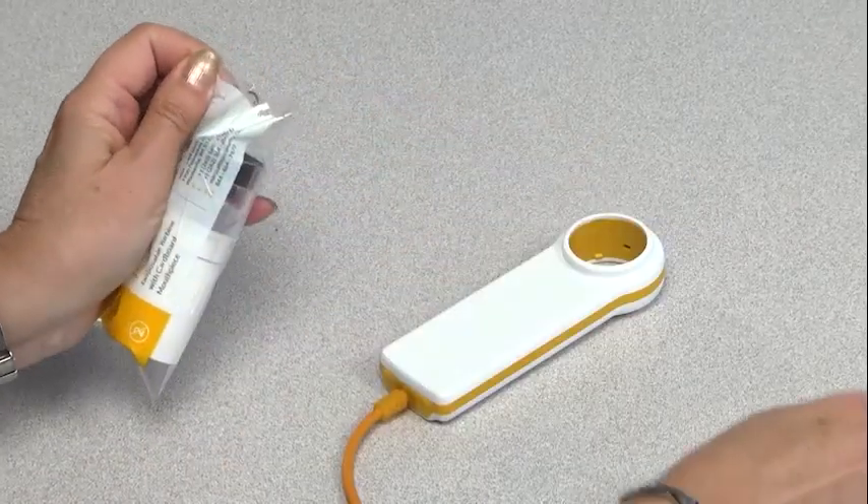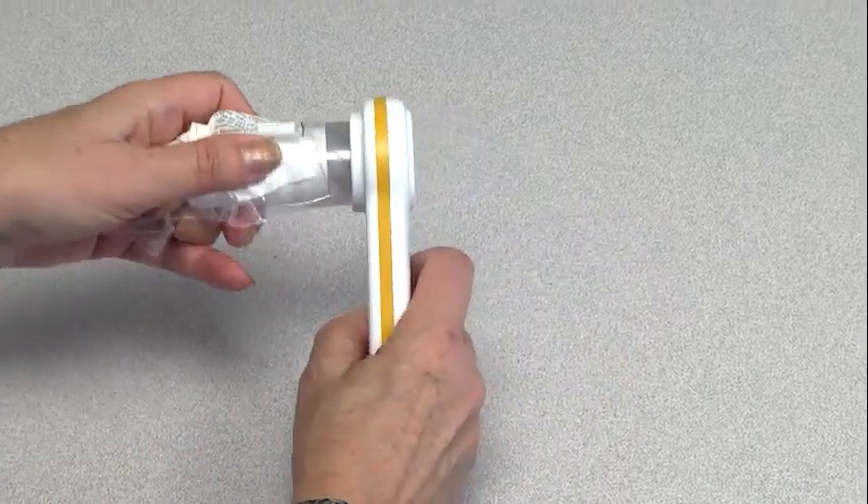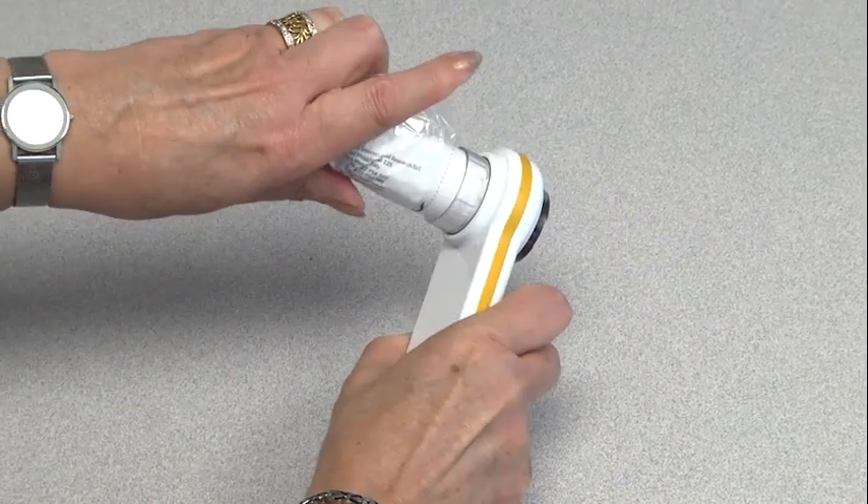To use the SpiroLab, open a new FlowMir and insert it into the device. Lock it in place by twisting clockwise.